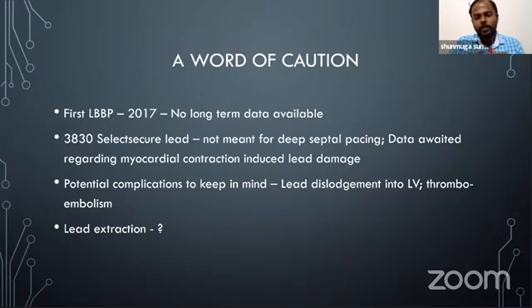As for the long-term effect on the lead, since you are burying it inside the septum, almost 10 millimeters of the lead is inside the septum. So we don't know whether myocardial contraction is going to produce insulation problems for the lead. That data is awaited, and you have to keep the potential complications in mind.